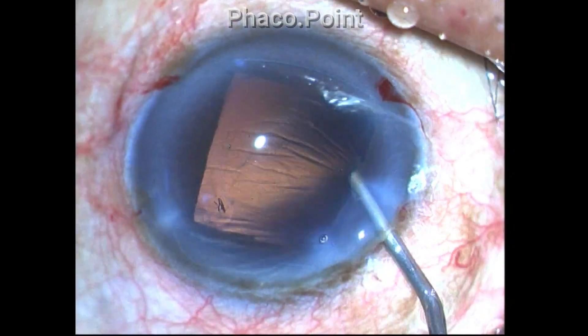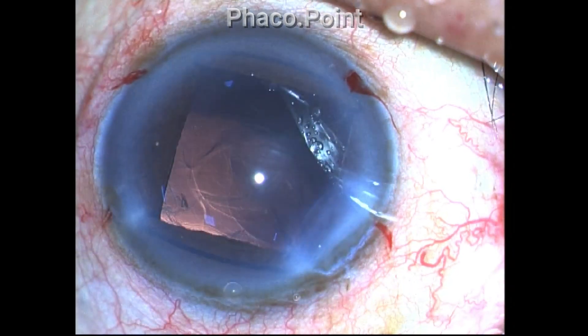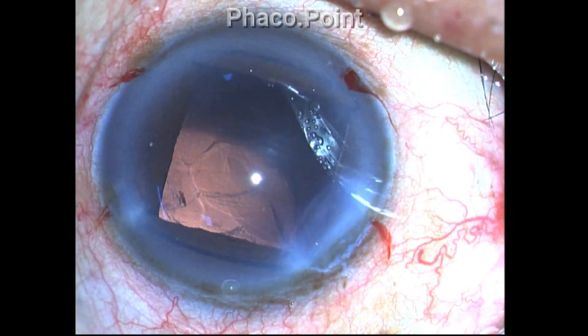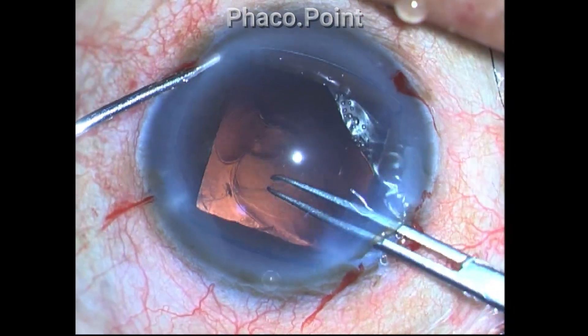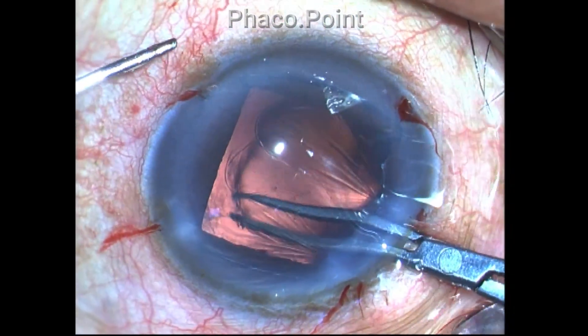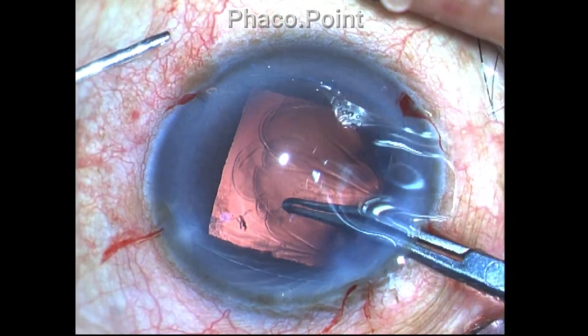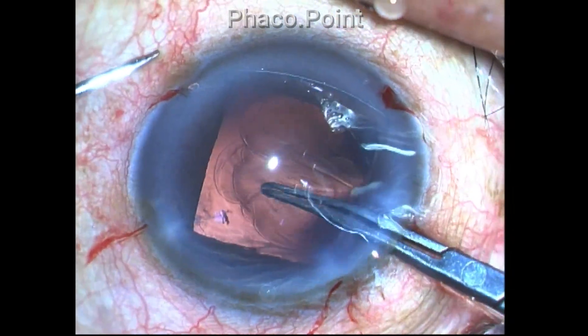The nucleus had been completely removed. The cortex has also been completely removed except for a few stray bits. At this point I try to convert this posterior capsular rent opening into a posterior capsulorexis.